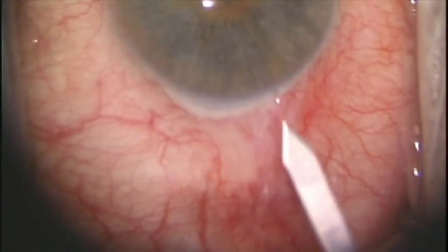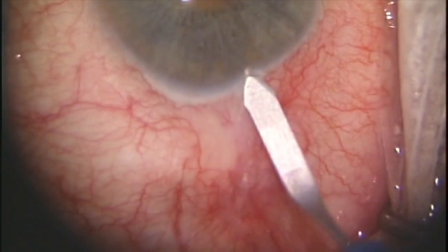You want to use high magnification so that you can really see the anatomy. The problem with high magnification is that you lose depth of field, and so you'll very easily go out of focus. So what I'll typically do is advocate going high magnification initially to see the tip penetrate into Schlemm's canal. And once I'm sure I'm there, then I'll zoom out a little bit so my depth of field increases as I'm moving across.